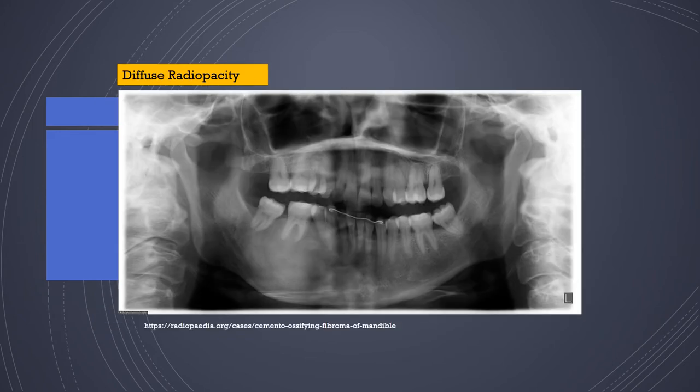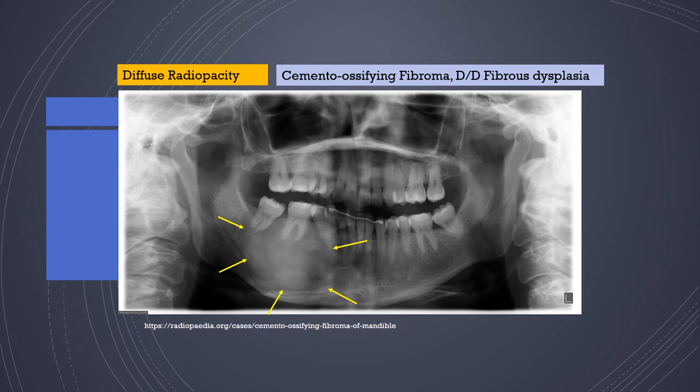Diffuse radio-opacities can also be seen clearly on panoramic radiographs, like the one seen in the right-side fourth quadrant, where there is a large diffuse area whose borders merge with normal bone. There is a change in trabecular pattern, and the entire bone appears opacified and ground-glass-like — consistent with a cemento-ossifying fibroma or fibrous dysplasia of the mandible.